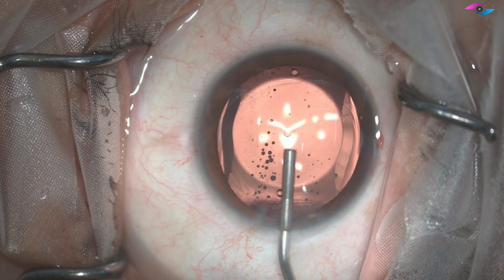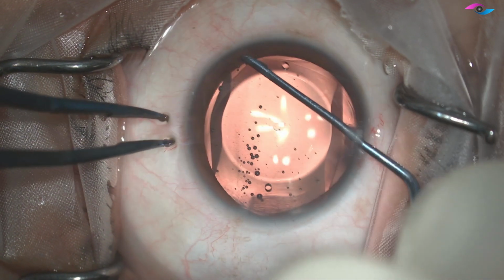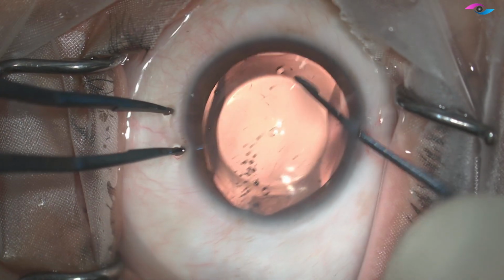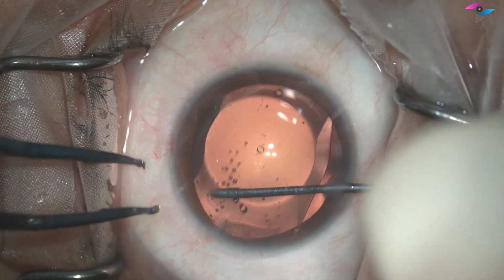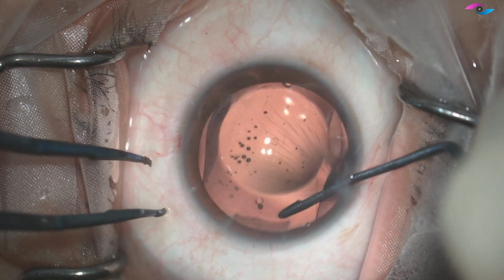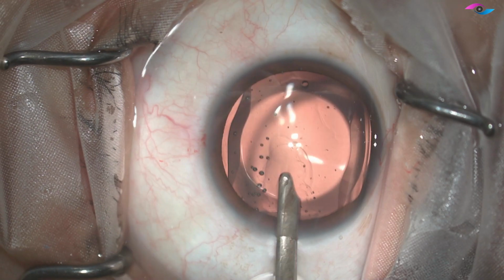Now we are using this special iris tucker instrument to tuck all the haptics under the iris, and we see here, although it was not my intention to directly place the haptics under the iris, while injecting, the two leading haptics have already gone under the iris. So the remaining are being pushed under the iris very gently and effectively with this instrument.